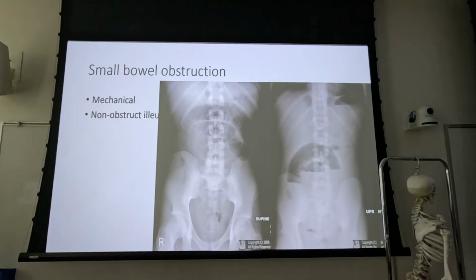With an intussusception, that's usually in adults secondary to a cancer, but in kids it's idiopathic. We don't know why it happens. But what you get is a telescoping of one bowel into the other. So you look at your bowel markings, and in the place of the intussusception, you see twice as many. It looks kind of like a slinky, and they call it the coil spring sign.